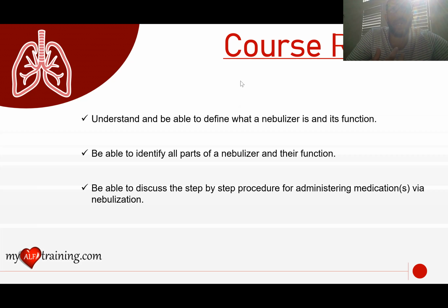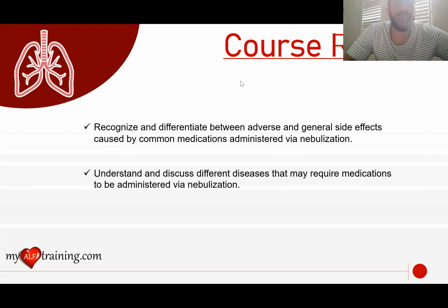We talked about being able to discuss the step-by-step procedure for administering medications via nebulization. We talked about washing our hands, how to make sure the patient is seated upright, and to make sure that we don't turn on the oxygen source or the compressor until everything is hooked up, because we want to decrease the amount of wasted medication and increase the amount of medication that is inhaled and given to the patient.